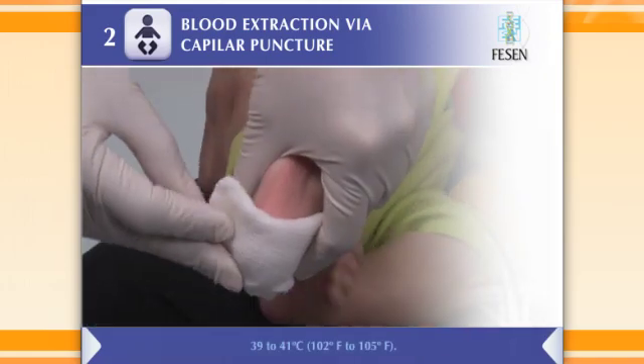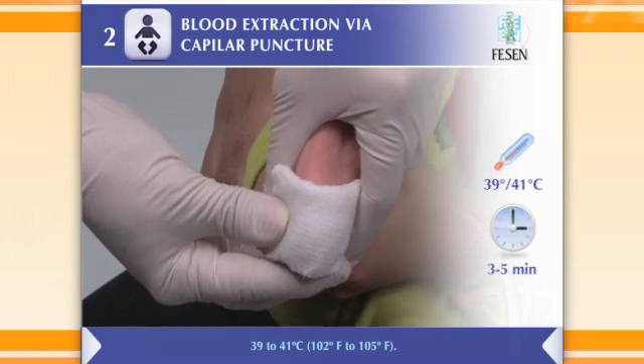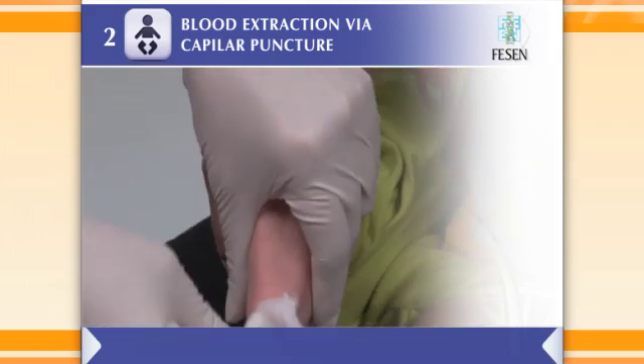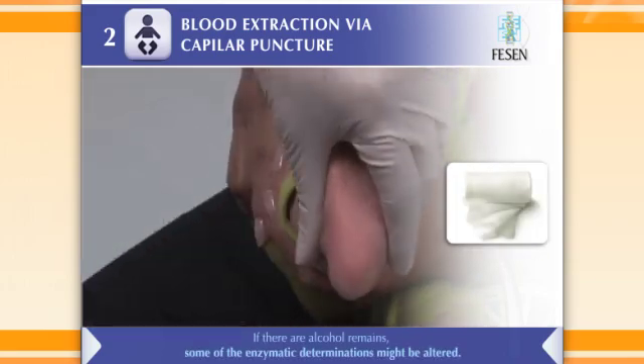Heat the extraction area by wrapping it for three to five minutes in a cloth soaked in hot water. Clean the puncture zone with alcohol, then dry excess alcohol with sterile gauze.